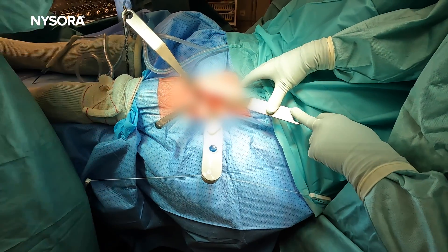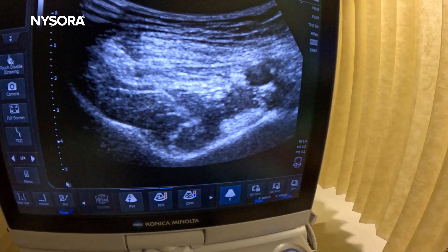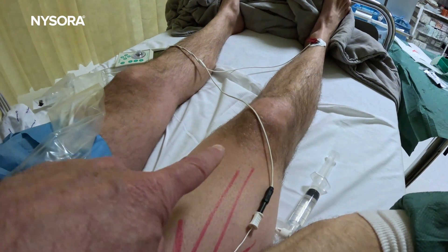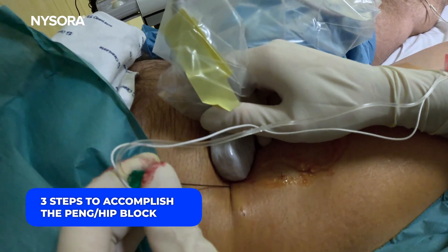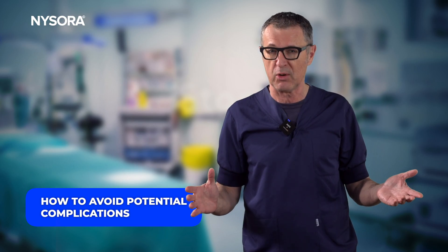The PENG or hip block has become a very common modality to treat pain in patients having hip surgery. While the technique is taught as easy to perform, there are efficacy and safety considerations that should never be overlooked. In this video we will point out three steps to accomplish the PENG or hip block and how to avoid the potential complications.